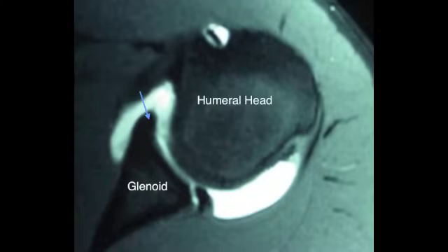The humeral head and glenoid are labeled on this shoulder MRI. The blue arrow is pointing to the anterior labrum, which is well attached to the glenoid. The white is the dye that's been injected into the shoulder. The red arrow points to the posterior labrum, and the yellow arrow points to the dye that gets between the posterior labrum and the glenoid, indicating a posterior labral tear.